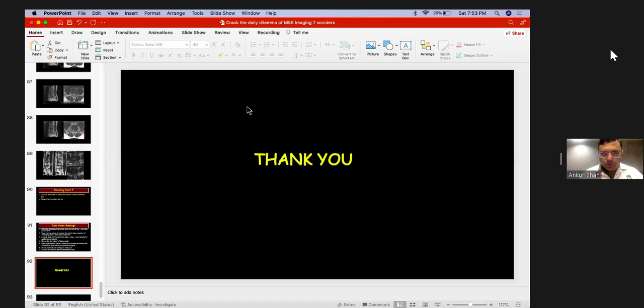So first is how to differentiate from sublabral recess. Well, the sublabral recess, if you look at the superior labrum, this is the glenoid and this is the labrum, the recess follows the shape of the glenoid. It goes more medially. The labral tears go more laterally. They go into the substance of the labrum. That is the characteristic of labral tear.